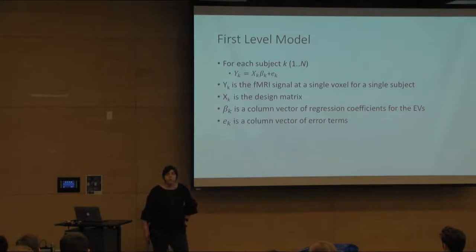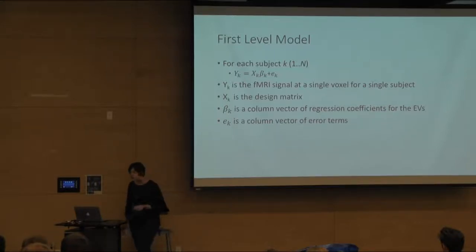So for those people who do resting state fMRI, what kinds of things do you think about with resting state? Physiological noise, right? So there's no reason for a task design that you have to omit those things, right? And some people do. You can think about bandpass filtering, for example, as a project where you include the regressors that represent the different frequencies, and you can put those in there too. But these are all things that go into this design matrix, right? And I think that some of these get shoved under the rug a little bit when you're working with fMRI software, so you might not be aware that they're all in there because they're occurring in different places, right? But you have to kind of understand what you're actually doing if you're going to take it out and take control of it and do it in R.